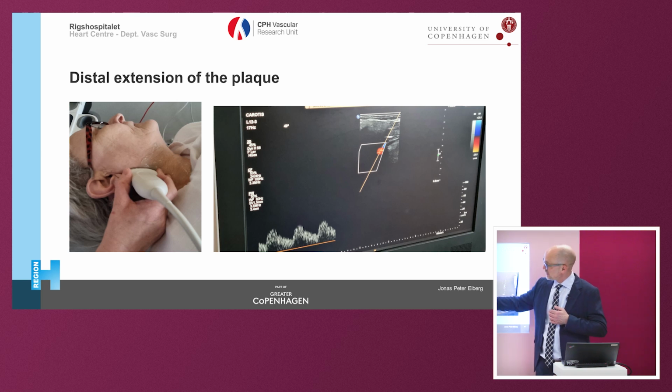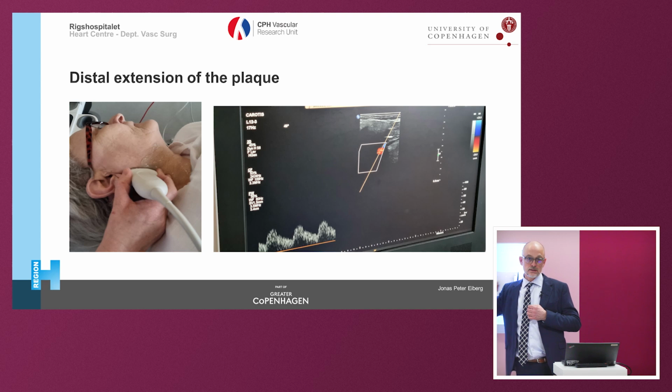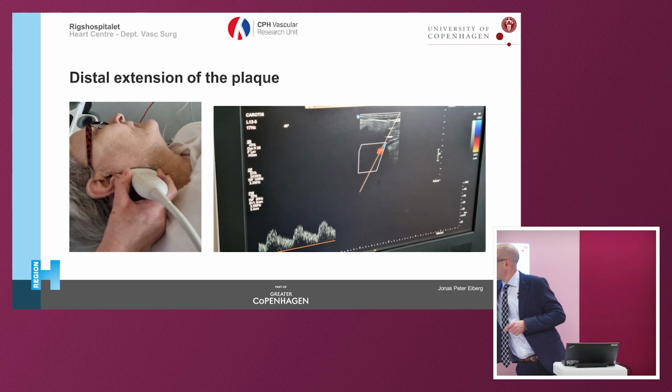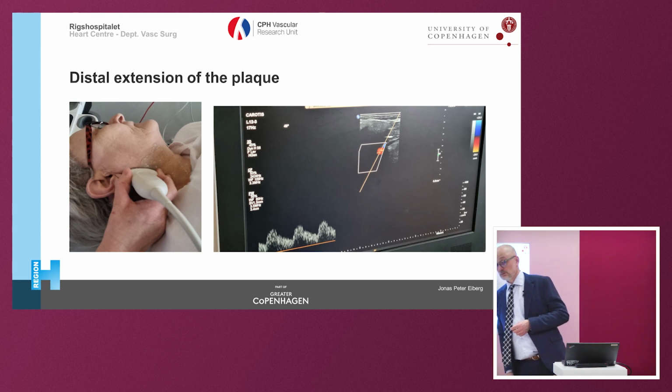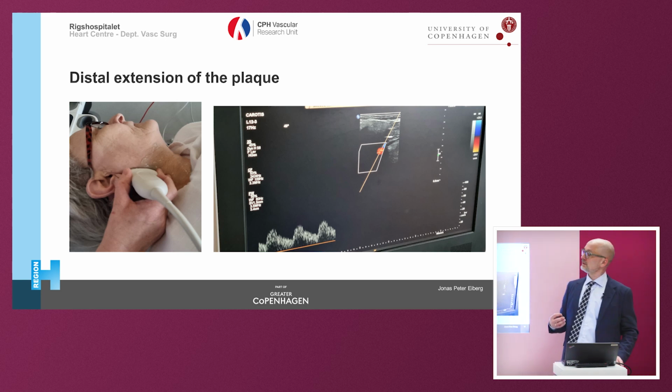This is the distal extension. You can see I cannot get higher with my transducer here. I hit the jawbone. This means I cannot, with my hands, get higher. So this is where I would decide if I can operate or not. So this, where Camilla has her thumb, corresponds to this area. Now this is not a good image, this is real life, but you can see that here I have a normal velocity. I didn't put on the measure, but actually during open surgery, I would be able to go here, because this is where I hit the jawbone. So I think it's a very practical and non-academic way to decide if you can put on your clamp or not.